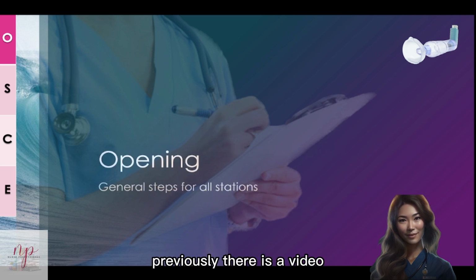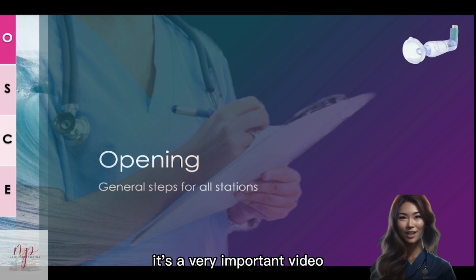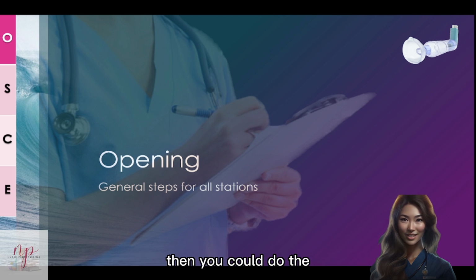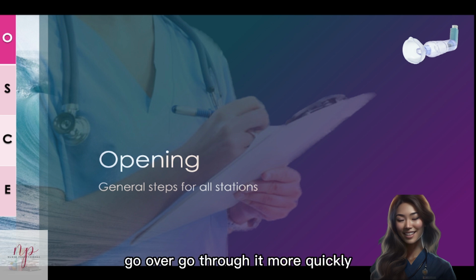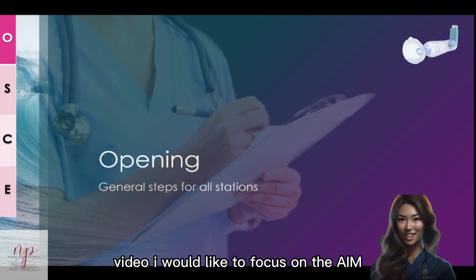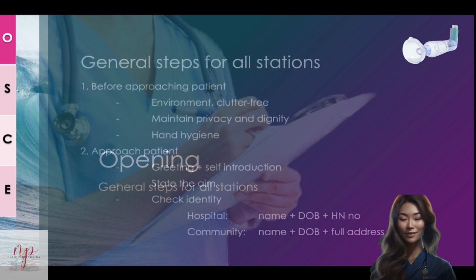Previously, there was a video. Please refer to the video for the OSCE Framework. It's a very important video, because after you understand the whole framework, you can complete the exam more easily. For the first few parts, the general steps, I will go through them more quickly, because in this video I would like to focus on the AIM, the administration of inhaling medication.